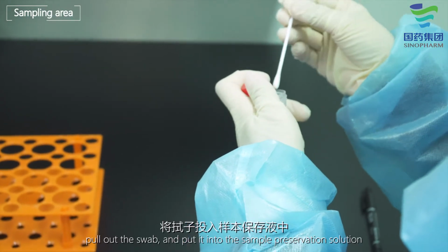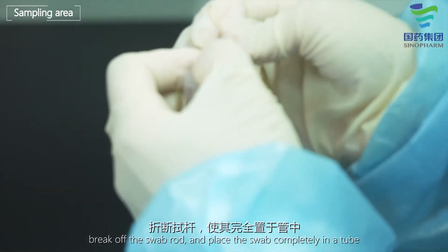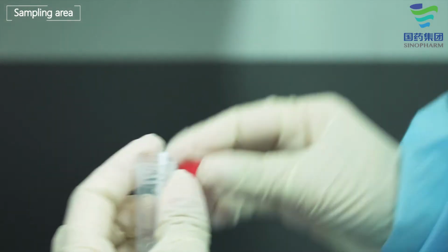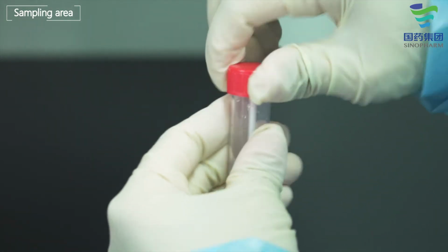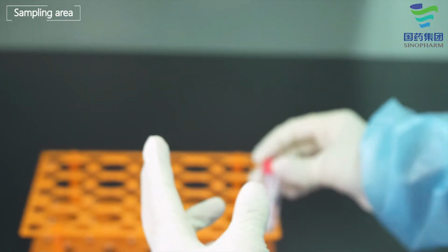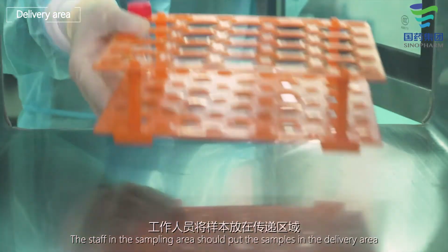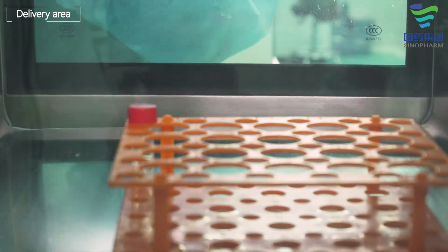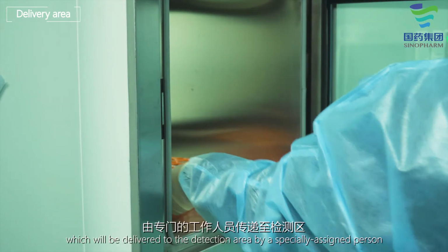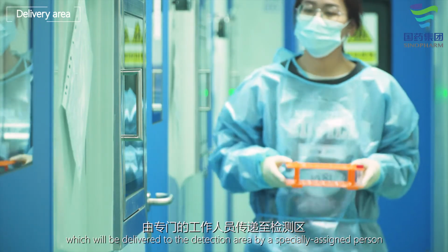Pull out the swab and put it into the sample preservation solution. Break off the swab rod and place the swab completely in the tube. Tighten the tube cap and make a mark. The staff in the sampling area should put the samples in the delivery area, which will be delivered to the detection area by a specially assigned person.